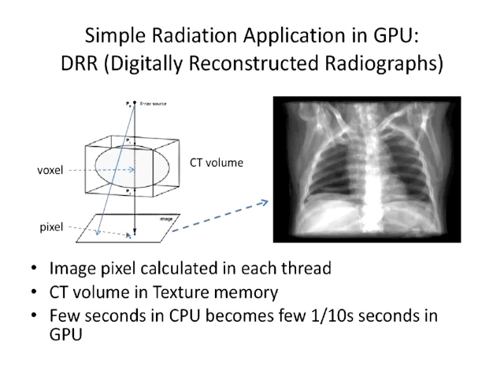It's a three-dimensional X-ray or three-dimensional volume. Here, this rectangular box is a patient. The patient is lying down, and the source photon, or X-ray, is going through. Then you can see the projected image on the bottom here. The two-dimensional image can be chest images or any body images.